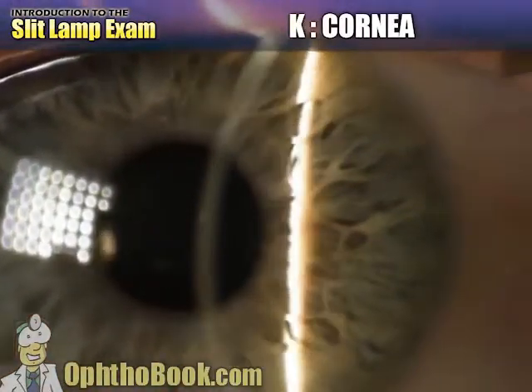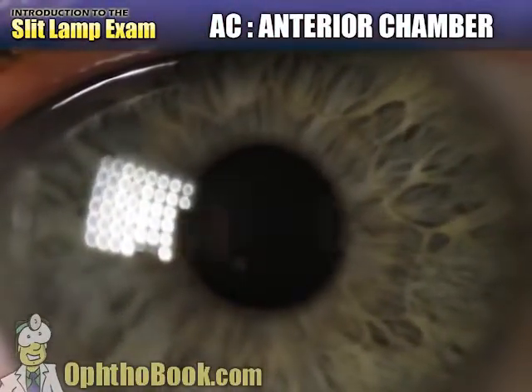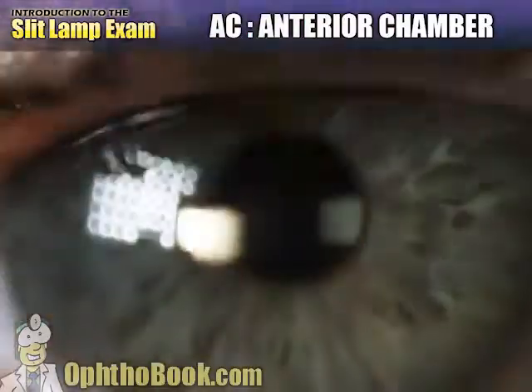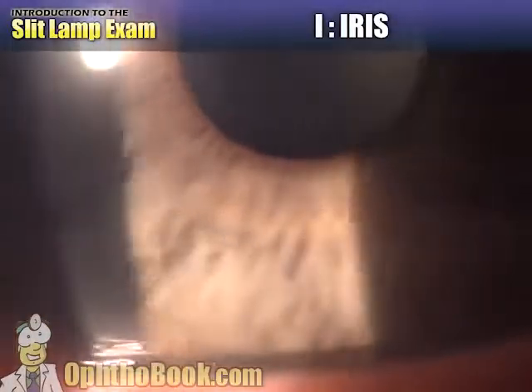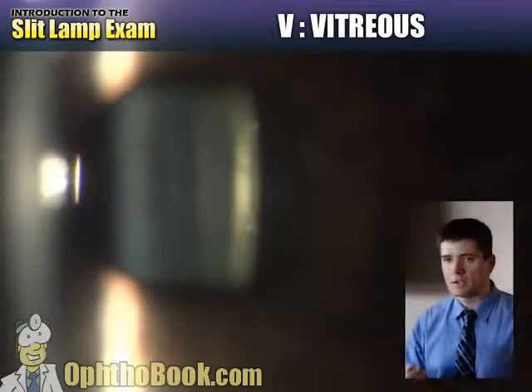Then we look at the cornea — I make a very thin slit of light, go across — looks clear here, no problems. The anterior chamber: I make my beam shorter, a little bit wider, use the pupil as a black background — looks deep and quiet. Then we move on to the iris, the easiest part to look at. Looking at our lens, we make a very thin slit beam to look at this clear structure. We can see the front and back of the lens, and behind that is the vitreous, which looks like a dark cavity back there unless there are other issues.